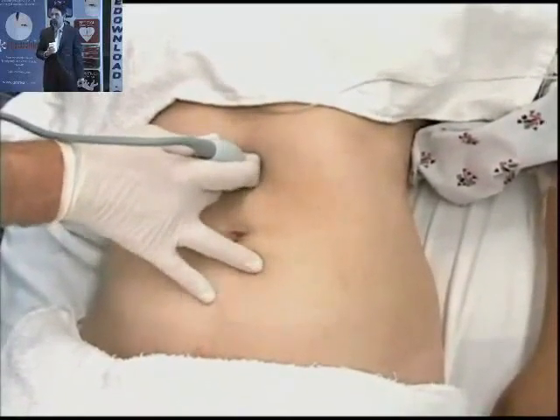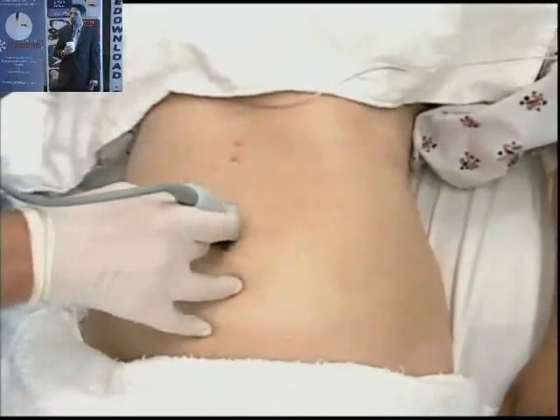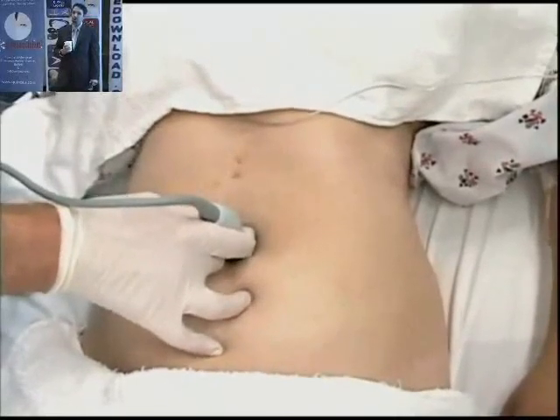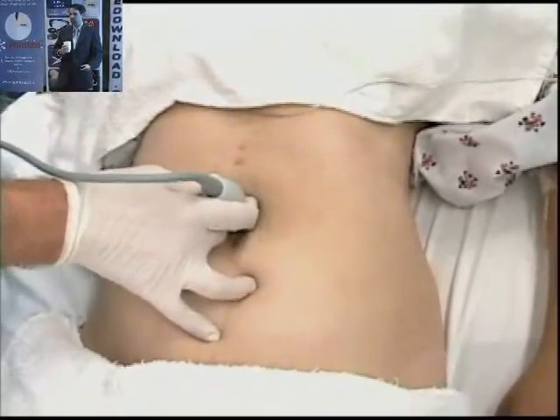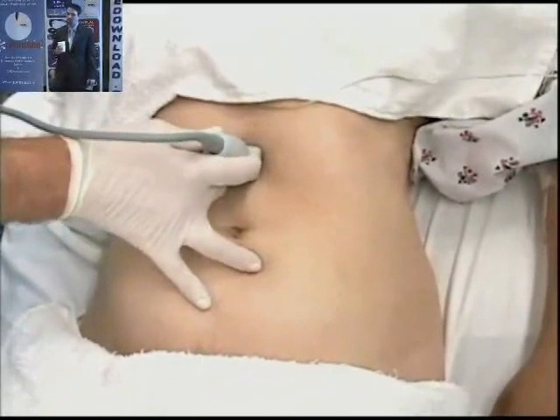Remember that most are low down. And you want to gradually progress up to the epigastrium to visualize the entire aorta. While you're imaging right above the umbilicus, it's also important to direct the probe inferiorly. Direct it down a little bit into the lower abdomen until you can see the bifurcation.